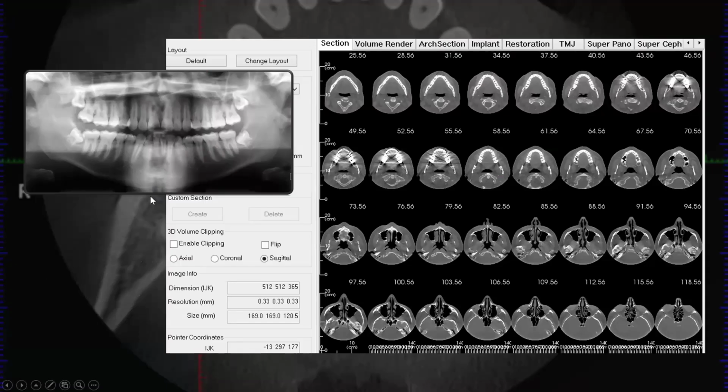And this is just showing we've got our single image when we're looking at a pano, but still it would take some time to go through and analyze these. You need to think about what structures you're looking at and make sure there's nothing abnormal outside of the field of view. And I always do that first, and then I go back and look at the dentition. Same is true when I'm interpreting a cone beam CT.